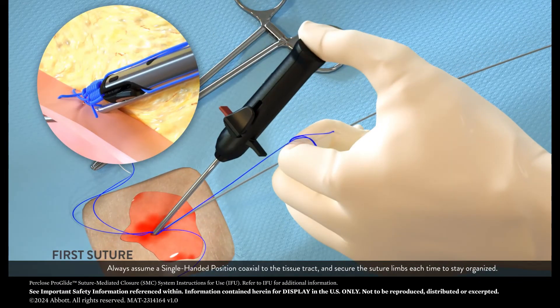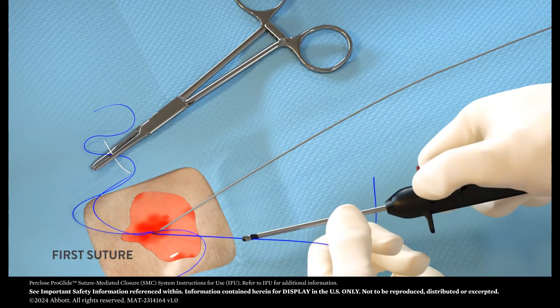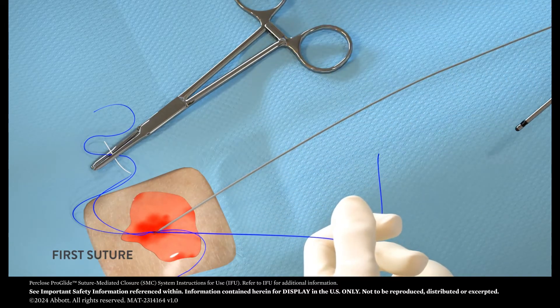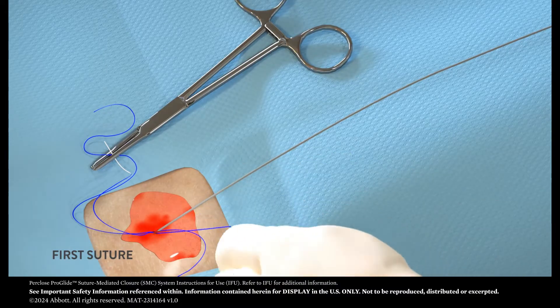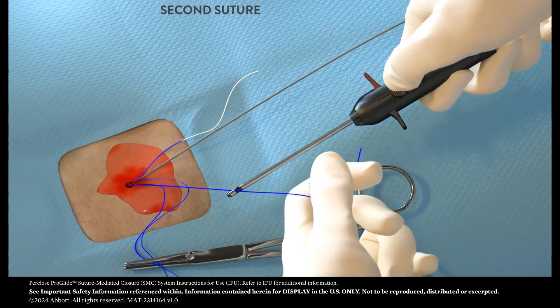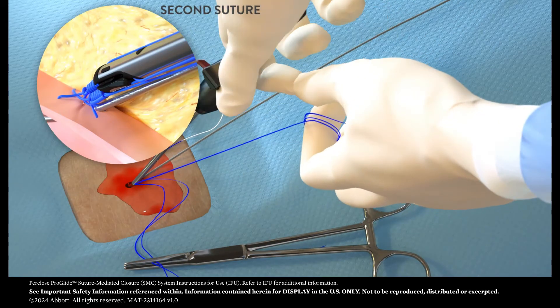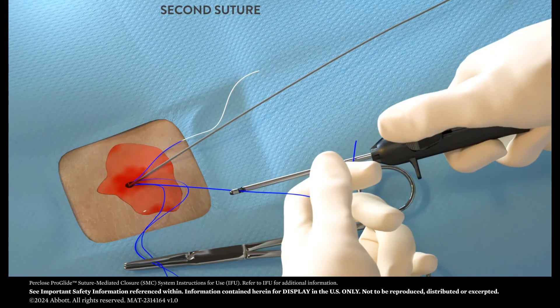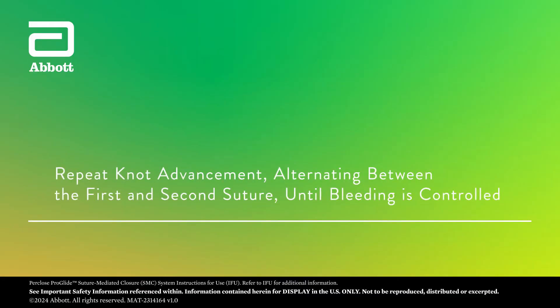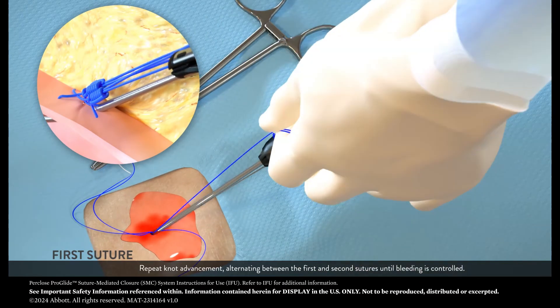Always assume a single-handed position, coaxial to the tissue tract, and secure the suture limbs each time to stay organized. Then go back to the second suture to do the same. Repeat knot advancement, alternating between the first and second sutures until bleeding is controlled.